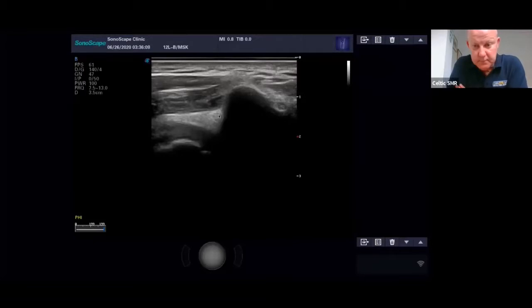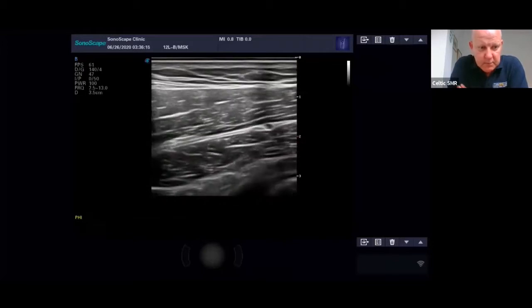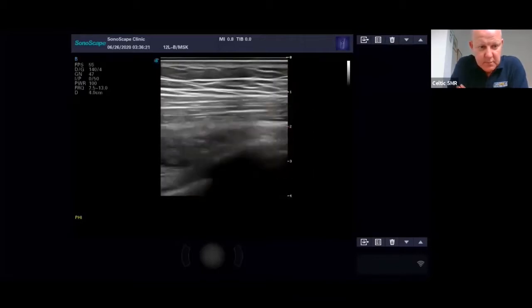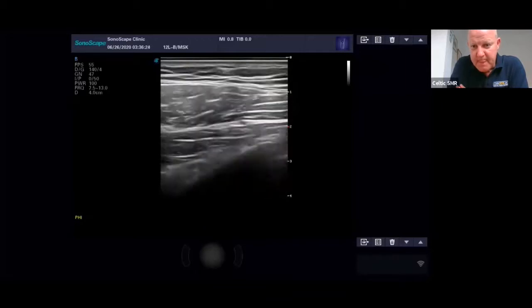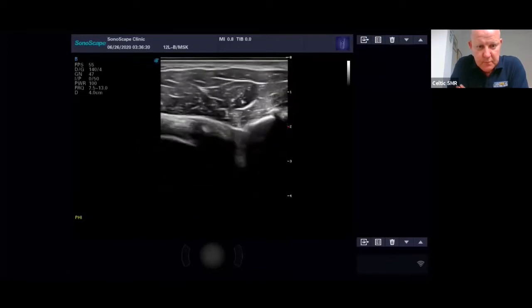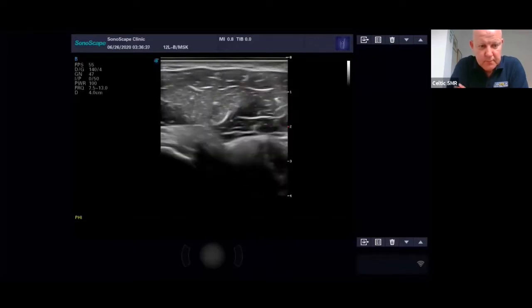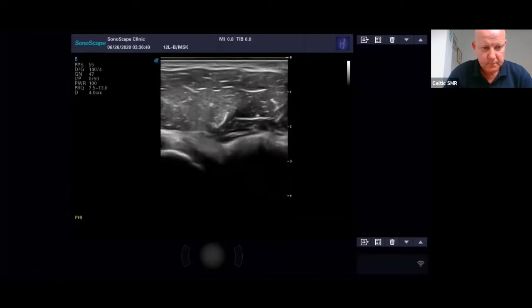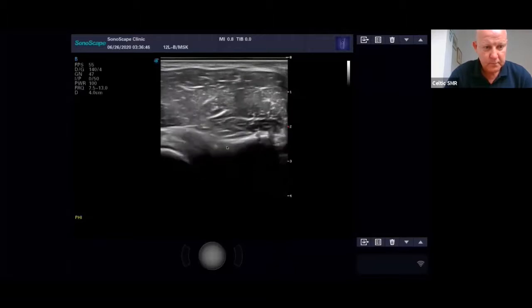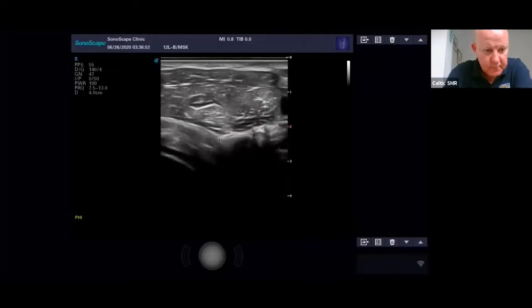There is another impingement sign at the coracoid. There's the coracoid, and then what you do is you externally rotate, and you can see that moving there on the screen. Here you'll get a bunching and some fluid up here, and that's called an anterior impingement.